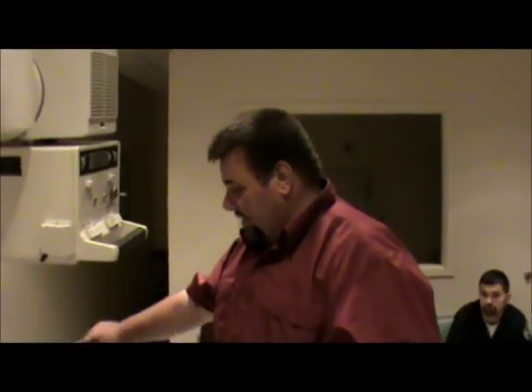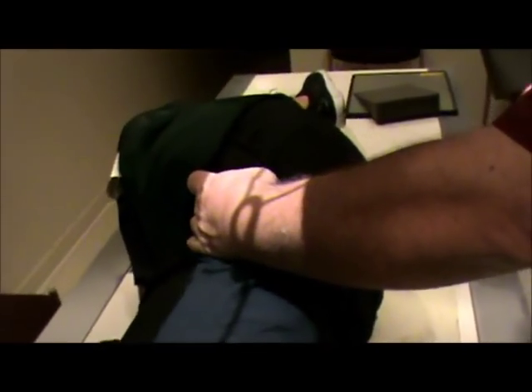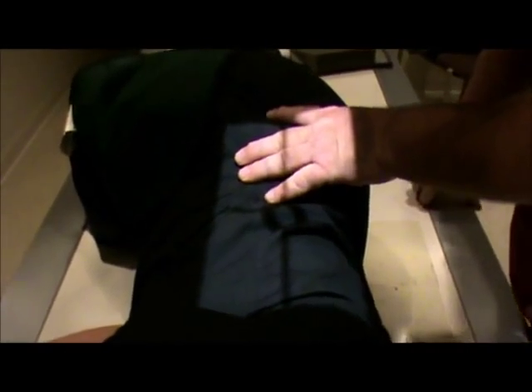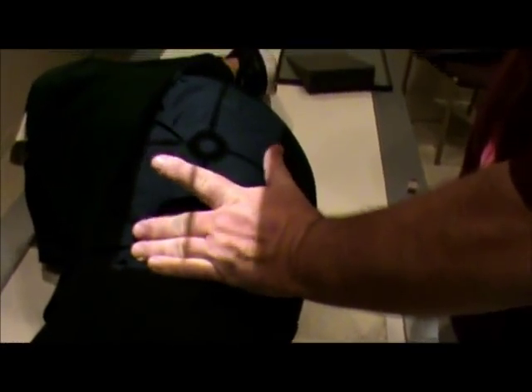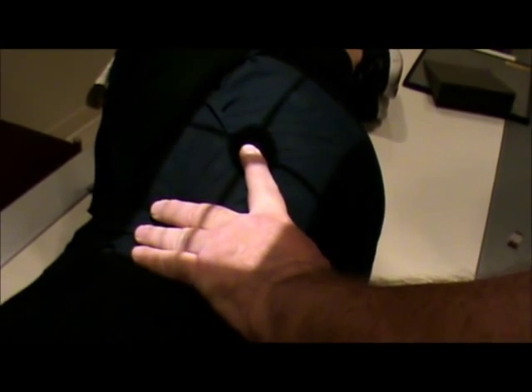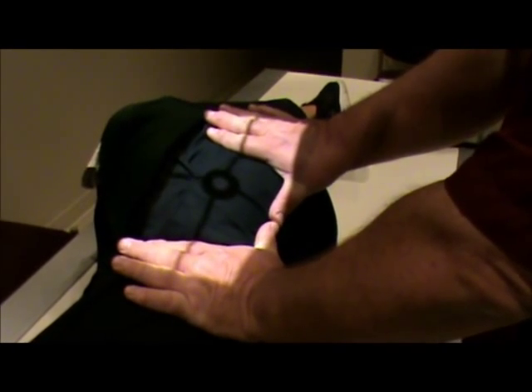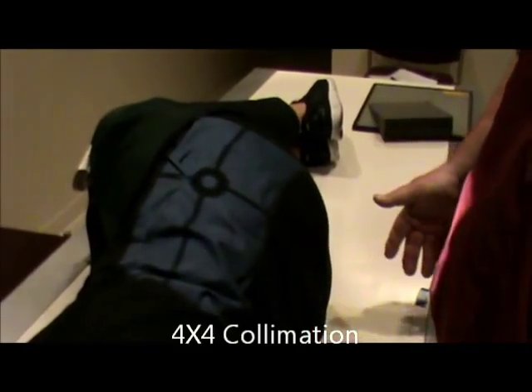There are several ways to do the spot film centering. You're going to palpate the ASIS on the patient, come back about two inches, and then from that point go down about one and a half inches. That should be approximately your centering point. One technique: put three fingers together, then spread the index finger out — the centering point will be at your fingernail. Another way is to put one finger and make an L shape, and the center of that is where you center. Both methods land on the same point — whichever way is easier for you, that's how you do it.